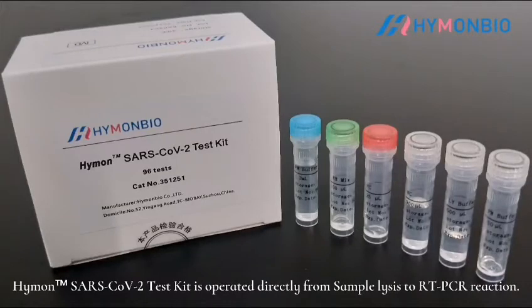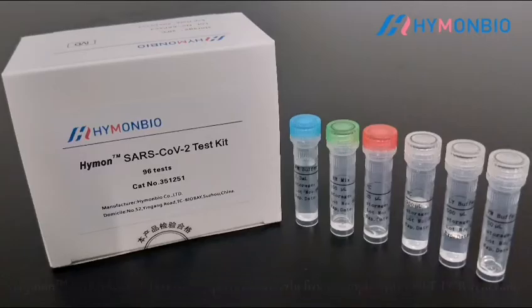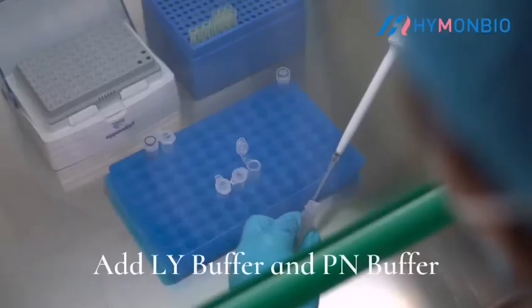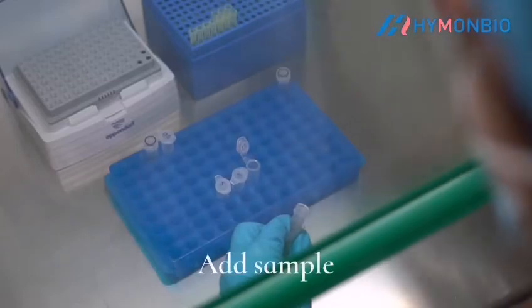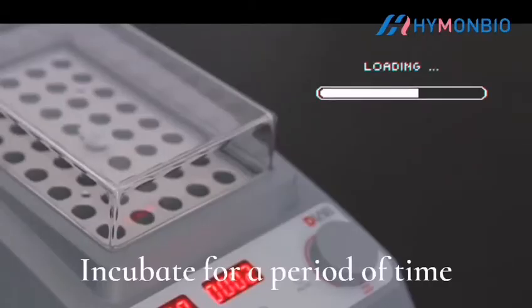The Hyman SARS-CoV-2 test kit is operated directly from sample lysis to RT-PCR reaction. For sample lysis, add LY buffer and PN buffer. Add the sample, then incubate for a period of time.